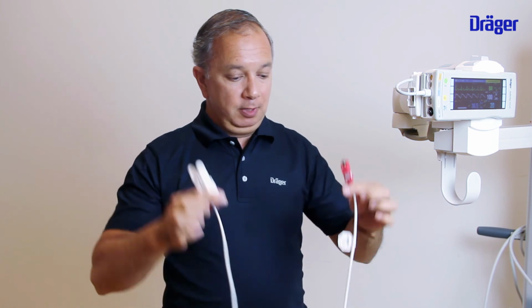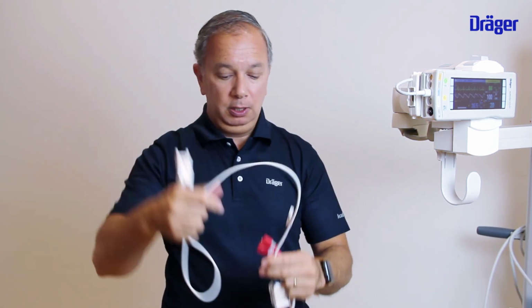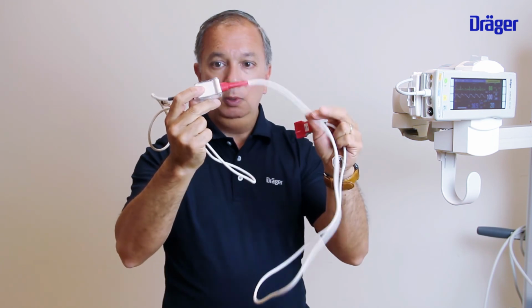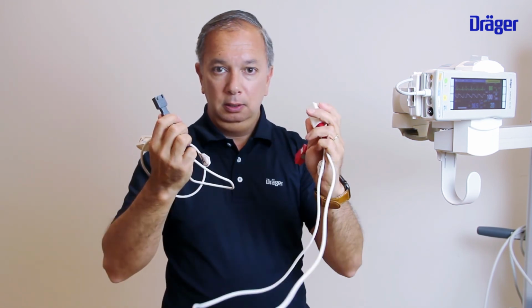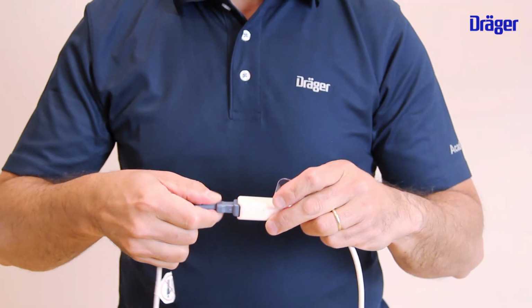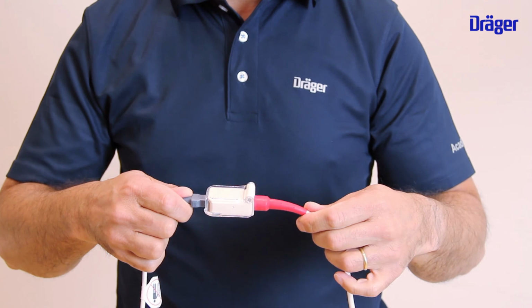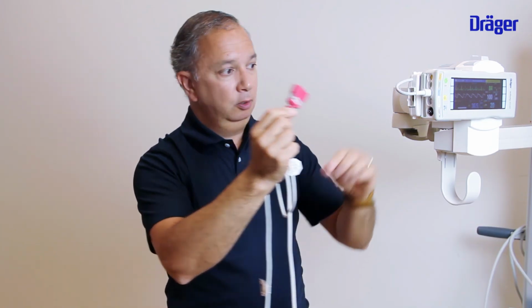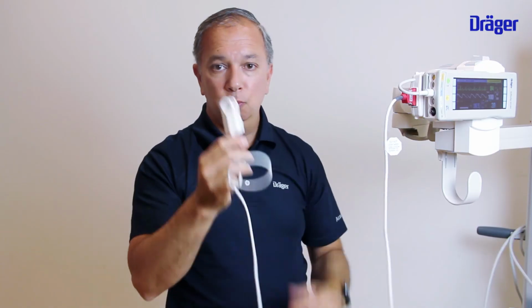Then you have your SpO2 cable, which has 2 parts. There is a patient sensor and there is an intermediate cable, and it's connected by this connector. So you connect the sensor to the intermediate cable, you close it, and then you connect your intermediate cable into your monitor. And now it's ready to use.